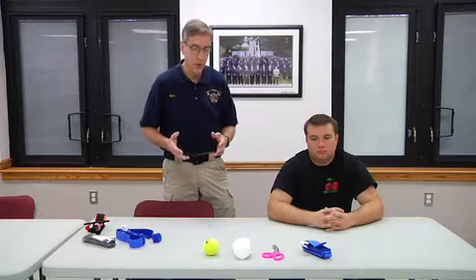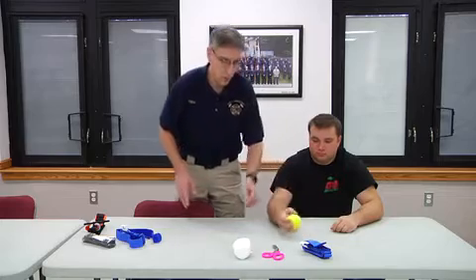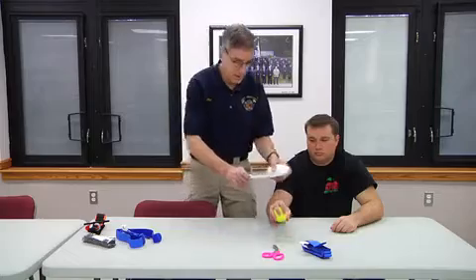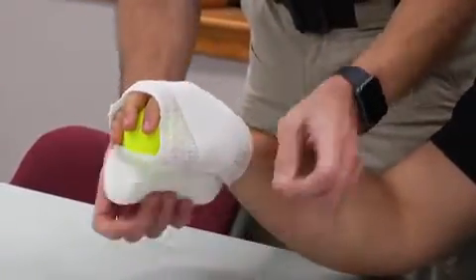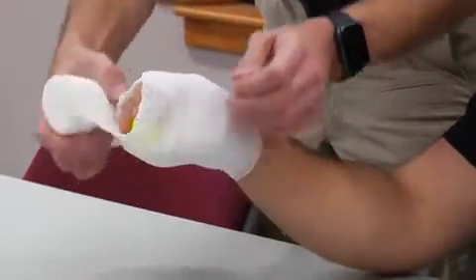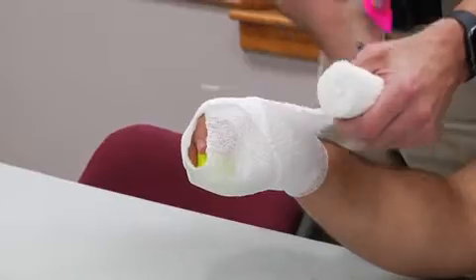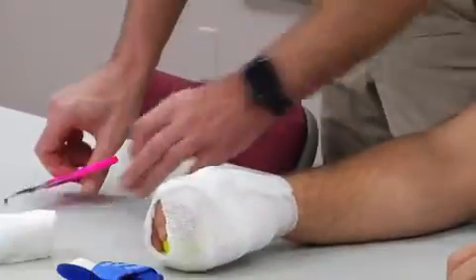What we're going to do is take the tennis ball and have our student hold the tennis ball, and then we're going to wrap the extremity in some cling. Wrapping the extremity in cling and using the tennis ball renders that hand useless, which is what would happen if you had an injury where you actually had to self-apply a tourniquet.